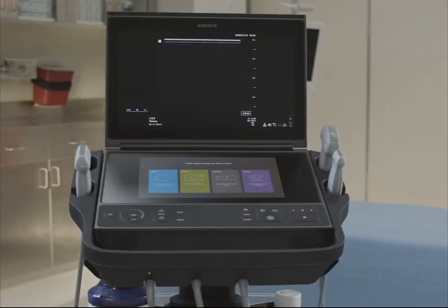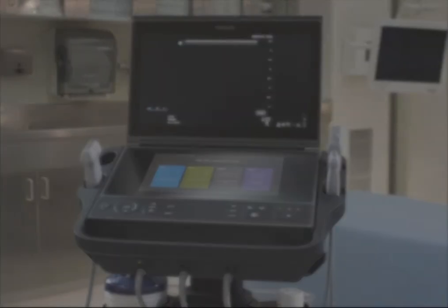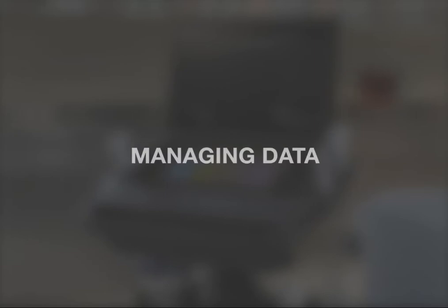Welcome to the Sonocyte PX help video, Managing Data. In this video, we will discuss how to set up storage options to prevent data loss while using your Sonocyte PX ultrasound system.